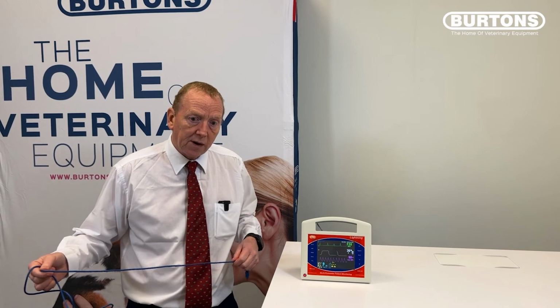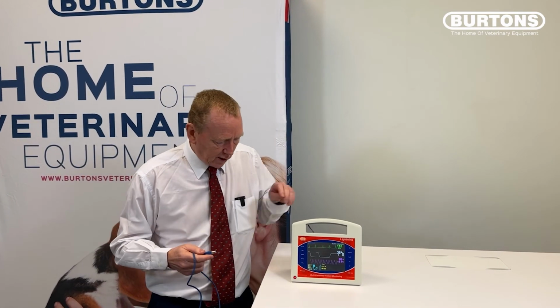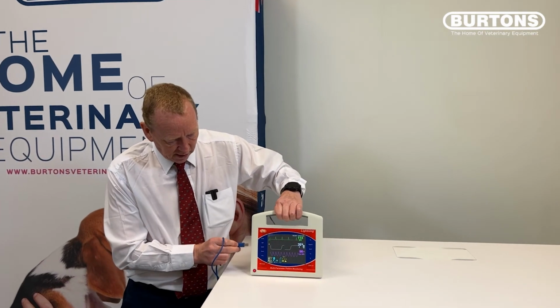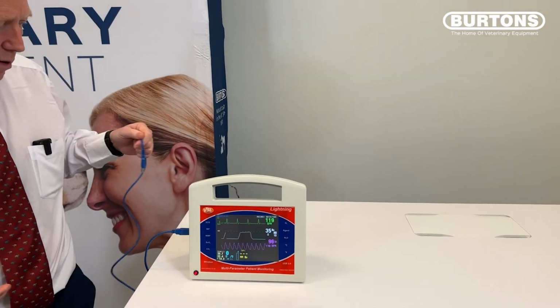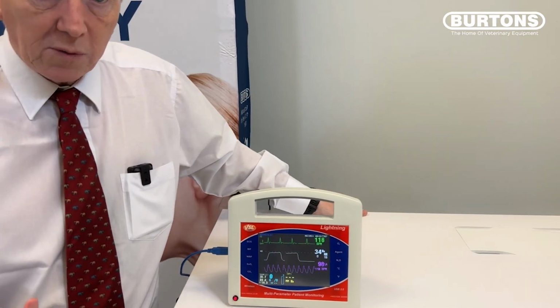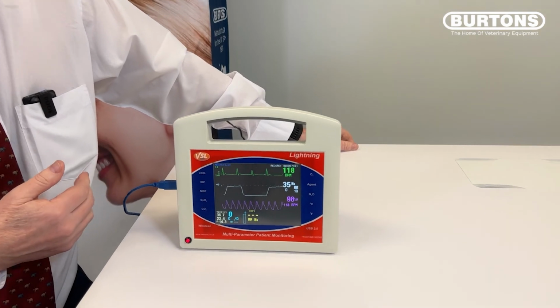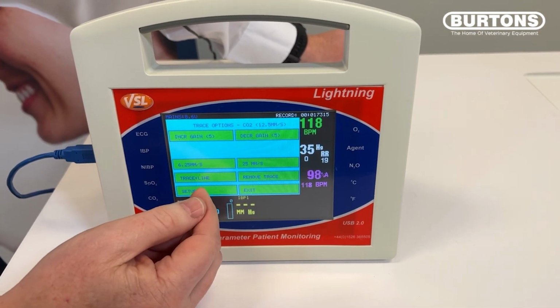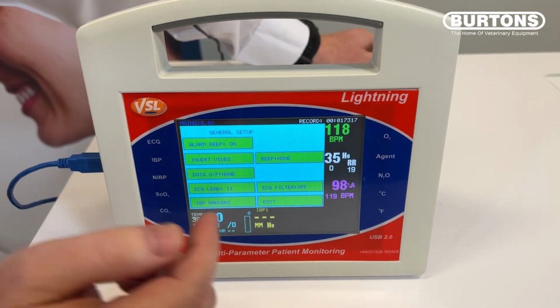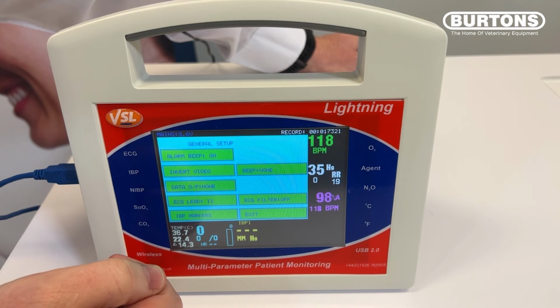So it's a very simple matter to do this. I just want to show you how to do this. So a standard USB cable, and we'll plug that into the USB port on the side of the unit, like so, and then this will go to our PC. And then one important point is that we need to make sure that the data is being sent from here in the appropriate manner. So if we touch the center of the screen, we get our menu, go to the setup menu, and we have an option called data output. And at the moment it's set to none.